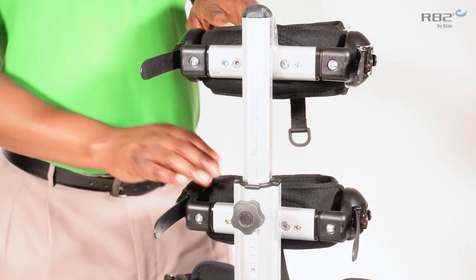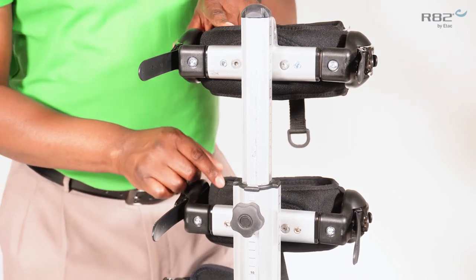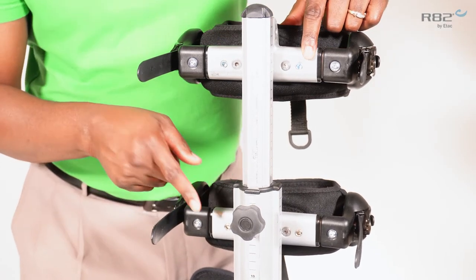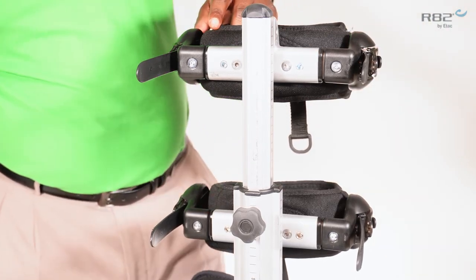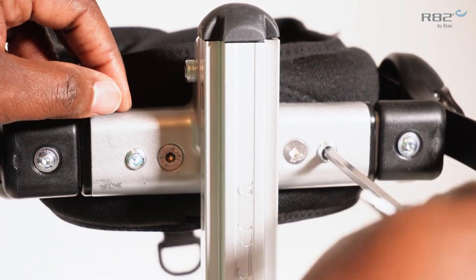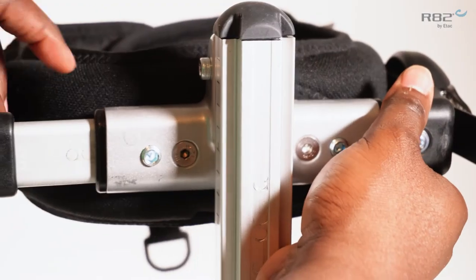The trunk support and pelvic support are both width adjustable. To adjust the width, locate the five millimeter bolts in the rear of the trunk support and the pelvic support. Once you loosen the bolt, you're able to adjust the width.